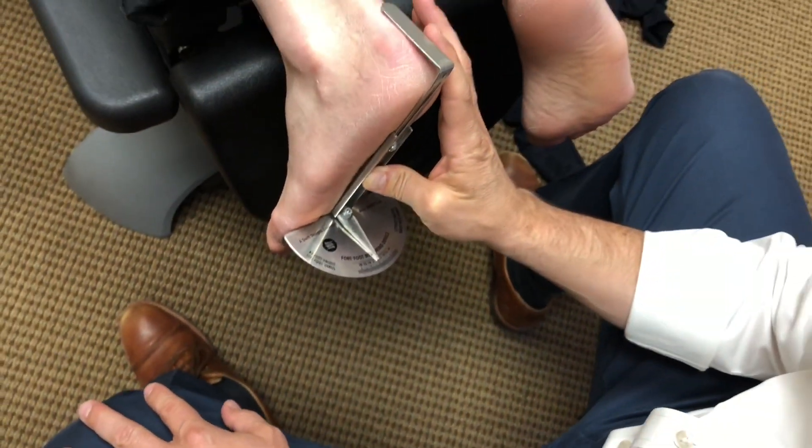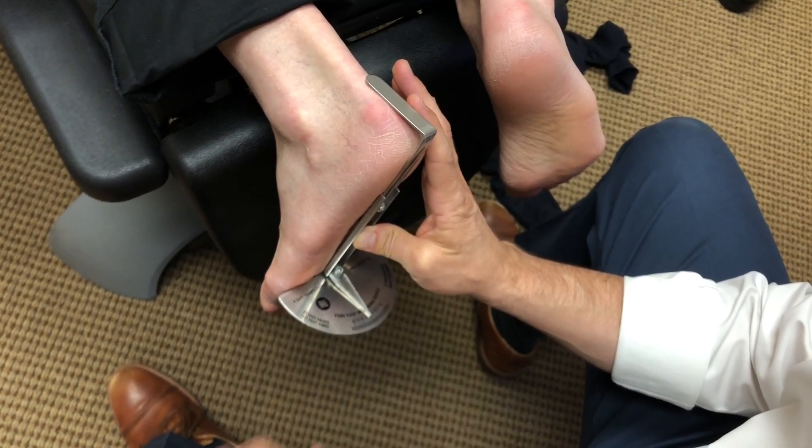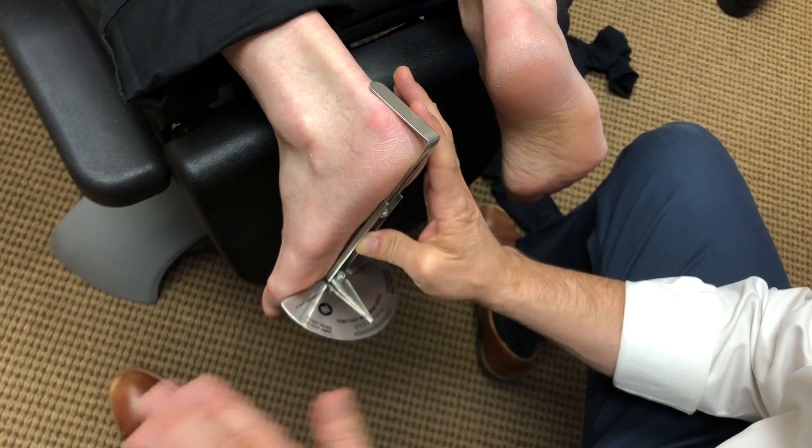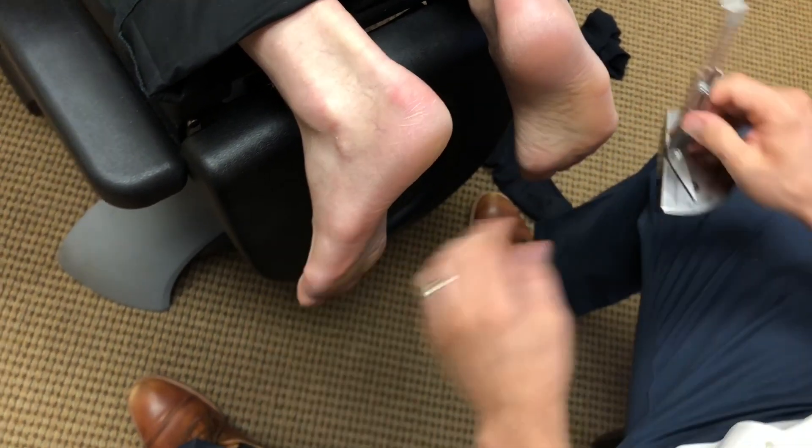It's pretty rare that we see a perfect zero. Normal range is zero to six — zero to four to six, in fact. But zero to six is the normal range, and that's perfect.